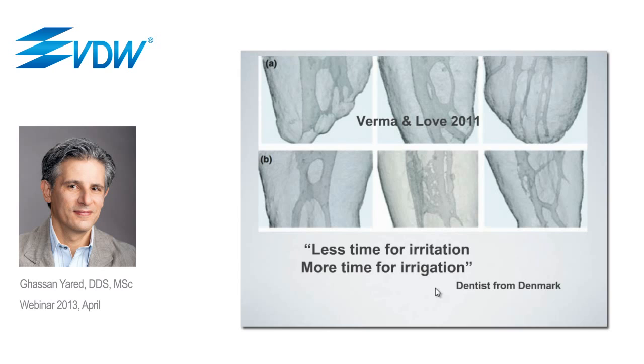And when you see root canal systems like this one, you understand that these are not systems that can be cleaned with an instrument. These cannot be cleaned with a Reciproc instrument, this can't be cleaned with a rotary instrument, no matter what type of rotary you're using. These systems can be cleaned with the irrigation. The final irrigation is the most important step, and this is what will clean these root canal systems.